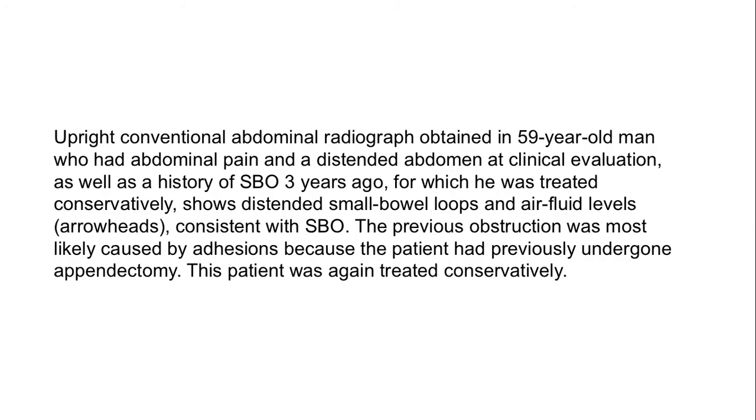It shows distended small bowel loops and air fluid levels consistent with SBO. The previous obstruction was most likely caused by adhesions because the patient had previously undergone appendectomy. This patient was again treated conservatively. I will make a lecture again about types of bowel obstructions. There are many types.